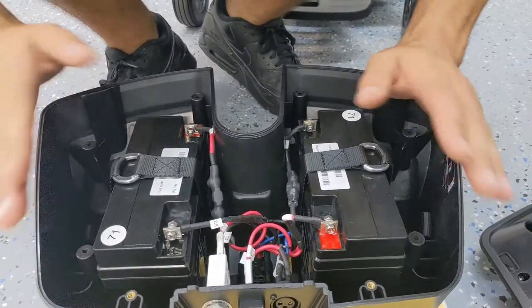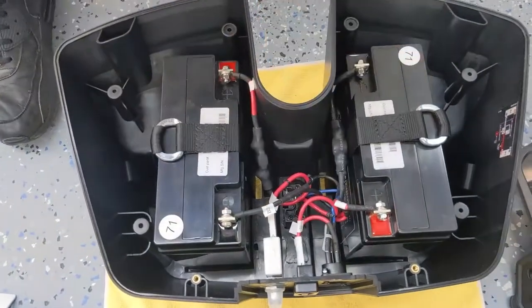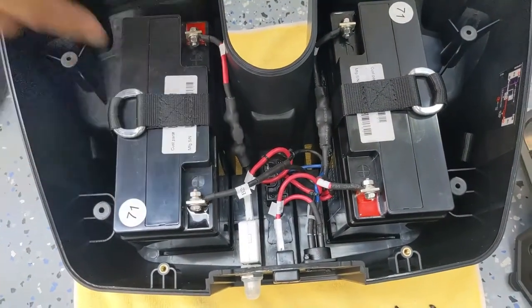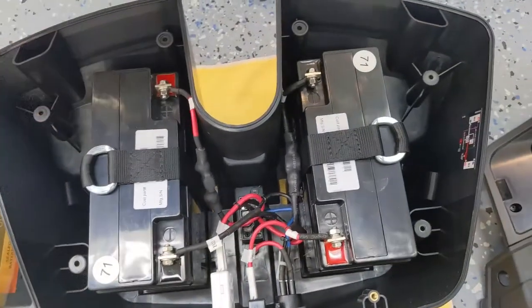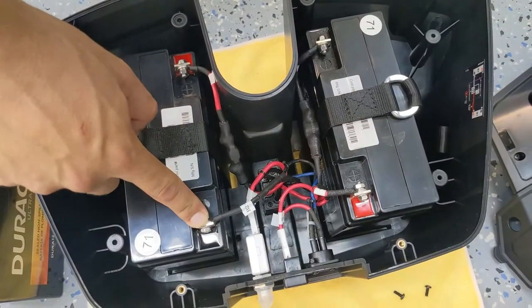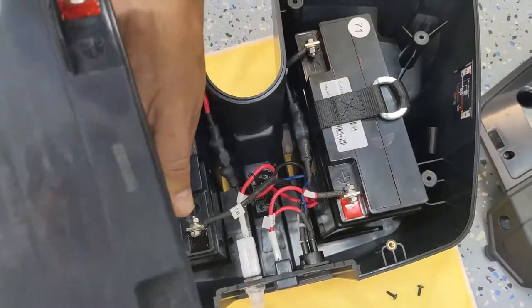And you've got the batteries exposed. As you can see, we've got two 12-volt batteries, each connected by a nut and a bolt. You take your new batteries and simply make the same connection one by one — take the red off of this one and the black off of this side and connect it to the new one, respectively, red and black side.